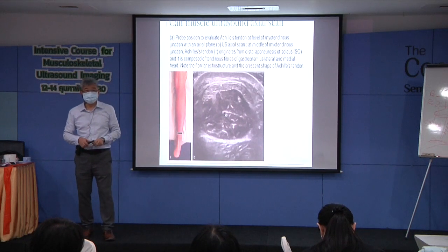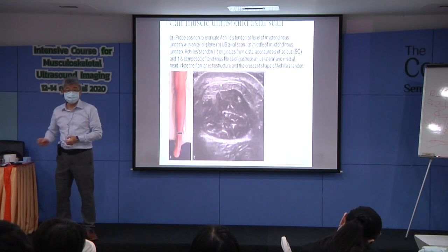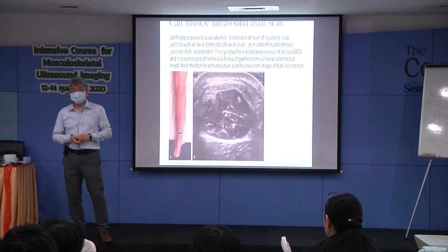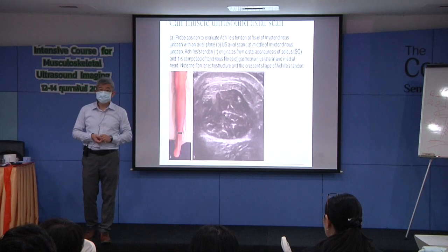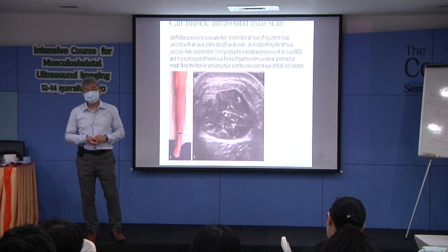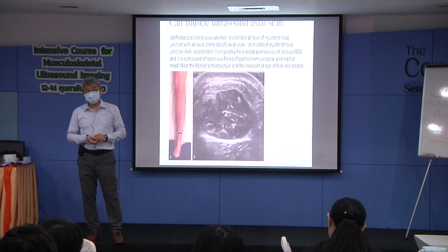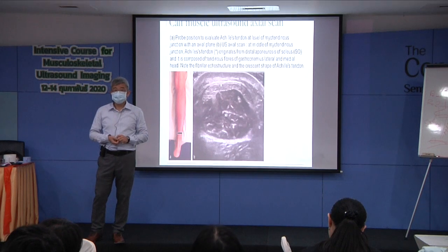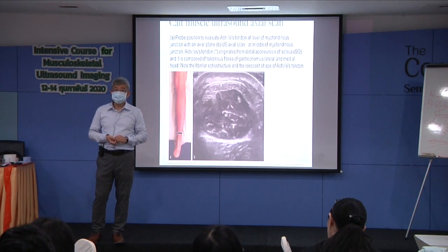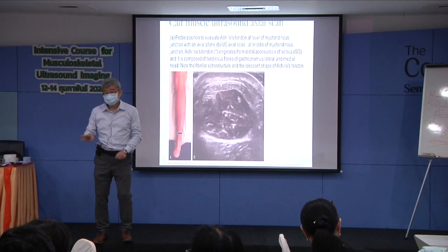Okay, now it's 15 past 11. I'm going to demonstrate the lateral side and the posterior side of the lower leg. Then we move to the medial side in the afternoon, and we introduce the medial ankle and lateral ankle. There are more than 15 structures in total. You understand, right? 5 ligaments.